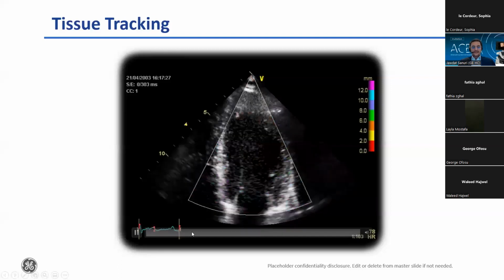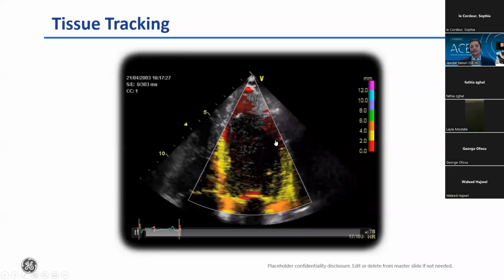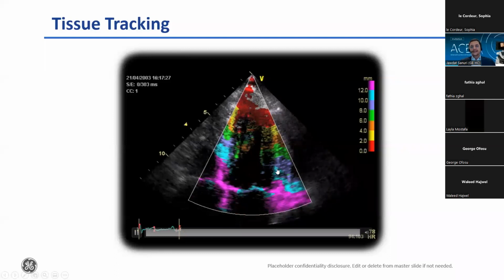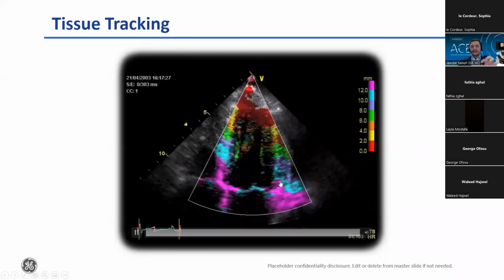If you freeze this beyond systole, nothing will change from there after in systole. It only shows the displacement during systole. And here it's showing this part has moved 0 to 2 millimeters, yellow 4 millimeters, orange 6, 8, 10, 12, and above 12 millimeters for the base. And you can see, even judging from this gradual change in color, that there is healthy longitudinal contractility throughout this LV from lateral wall as well as septum.